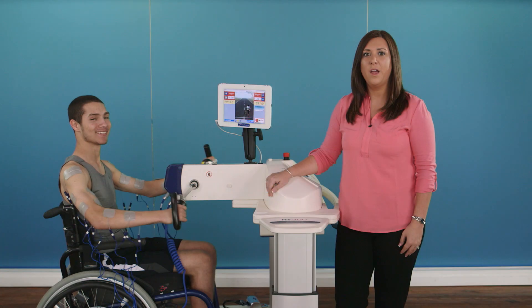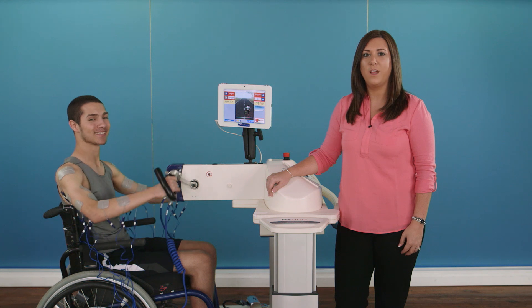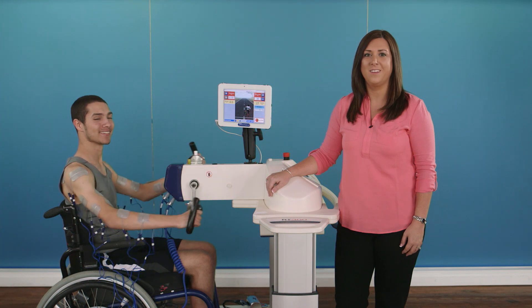The RT300 is a versatile therapy system, which you can use in your clinic with a wide range of patient indications, or in your home, providing a continuum of care for ongoing rehabilitation.